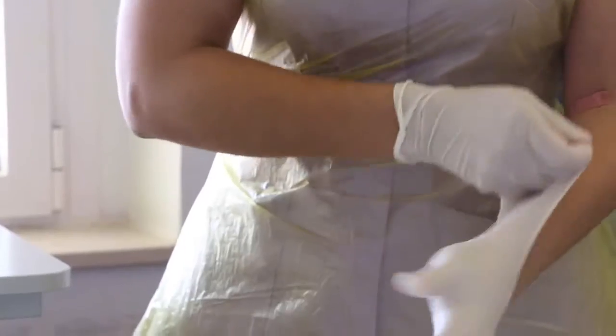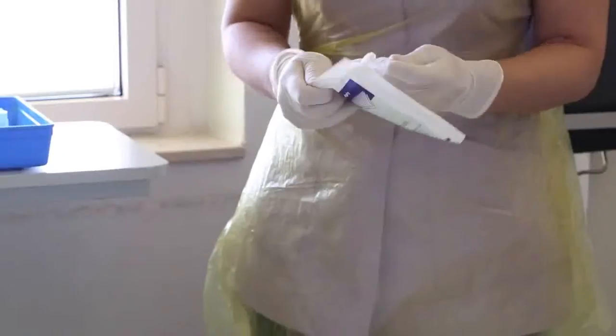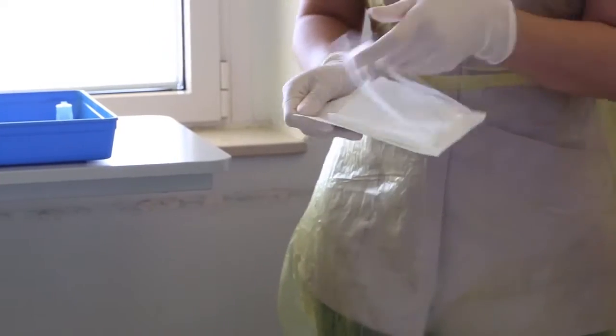Wear the apron. Put on non-sterile gloves. Open the gauze swab package as shown and without touching the swab, place it back in the tray.